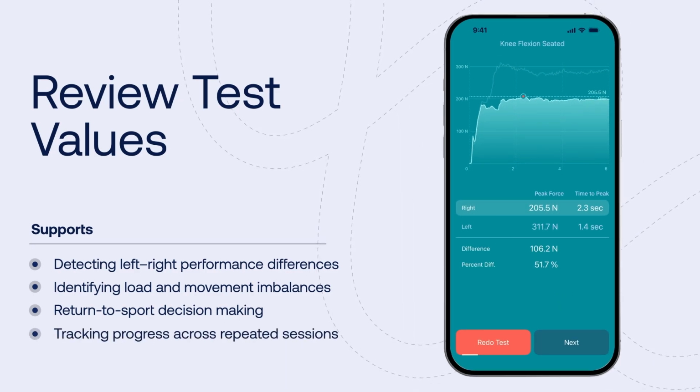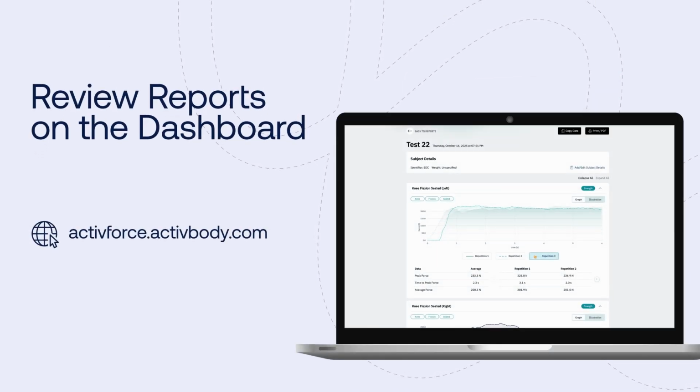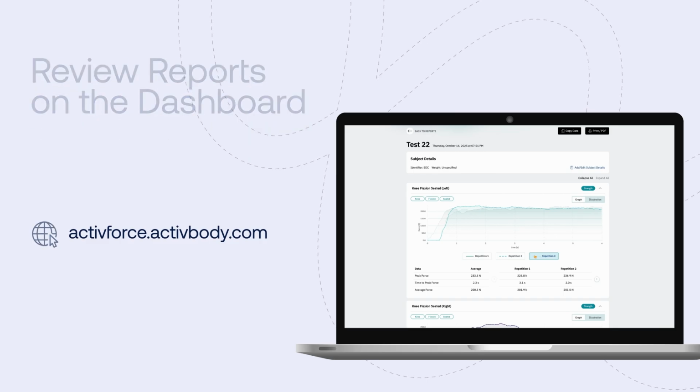You can discard and rerun the test to ensure accurate data capture. Comparing left and right side results with ActivForce gives you clear, consistent data for confident decision-making.